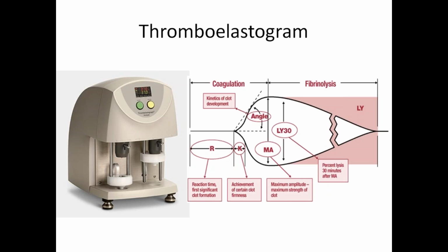and depending on which point is not normal, you come to a conclusion whether it's a coagulation factor deficiency or a platelet deficiency, or whether heparin or over-heparin is a problem. So you can determine that. It's quite useful. Generally, when the patient is bleeding on ECMO, you try to correct the coagulation and stop the heparin. If the patient is still bleeding, then you don't know what to do. Then you do these tests and they give an idea of what to supplement.